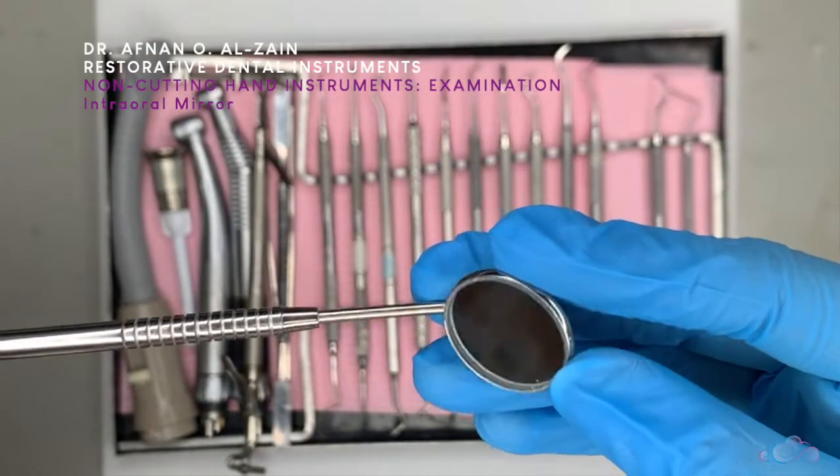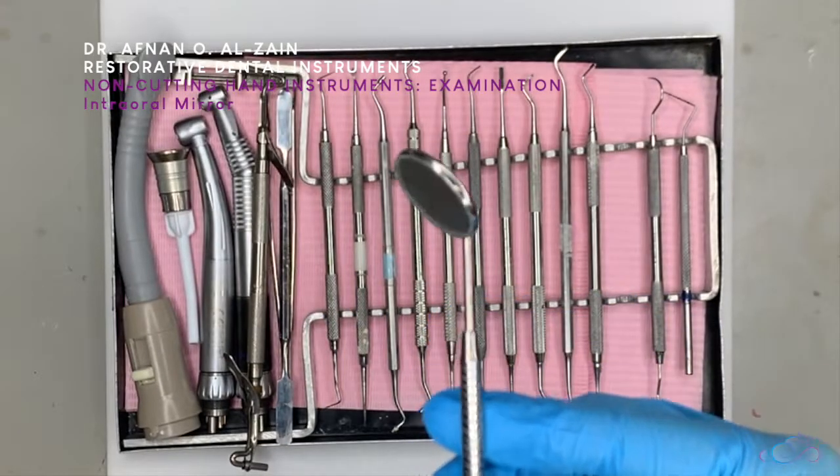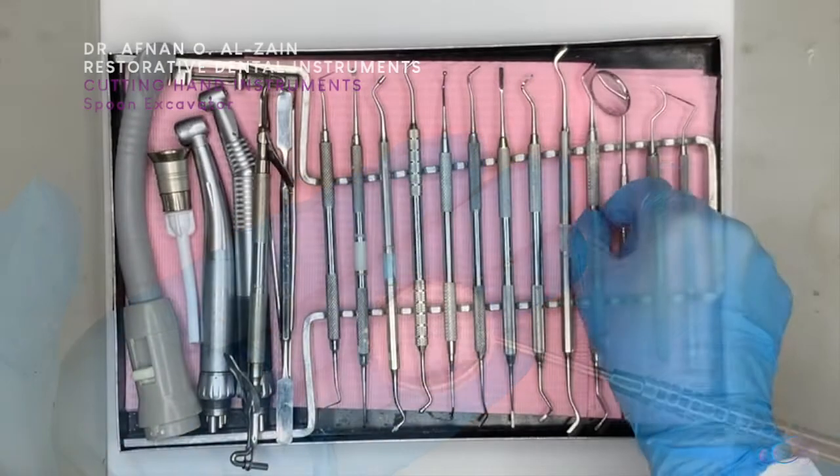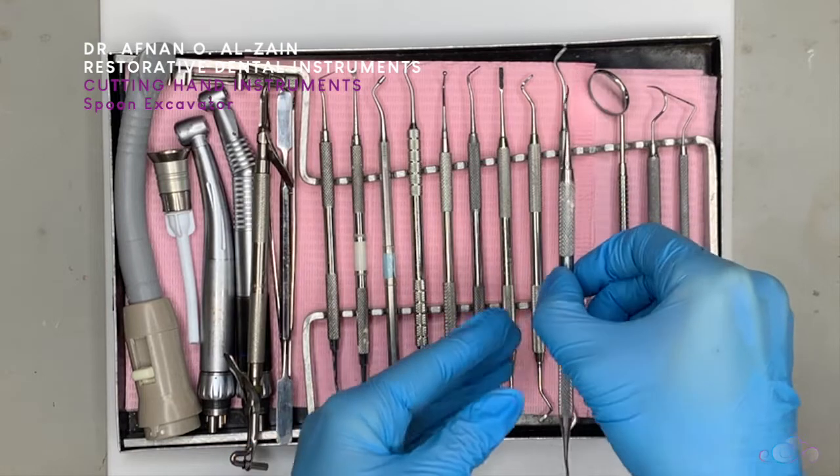After that we have the dental mirror, and it's used to retract the cheek and reflect the light. After that we go to the cutting instruments.